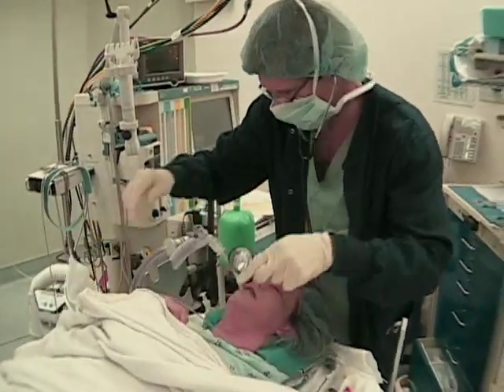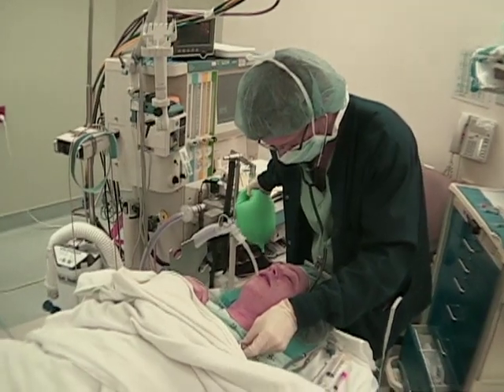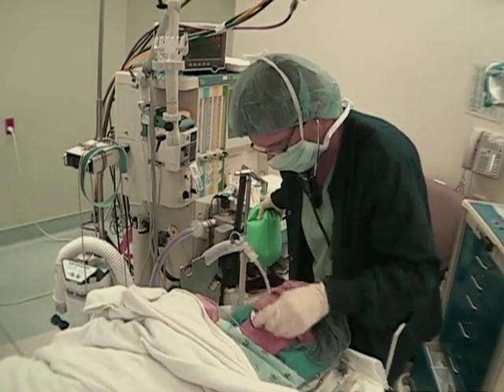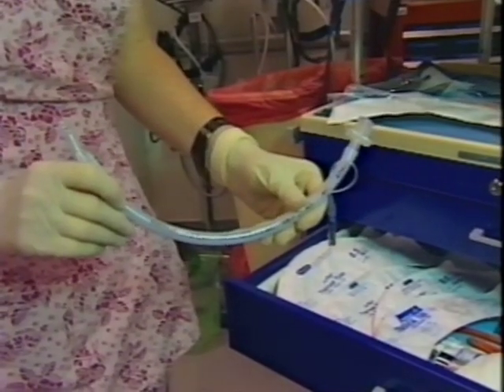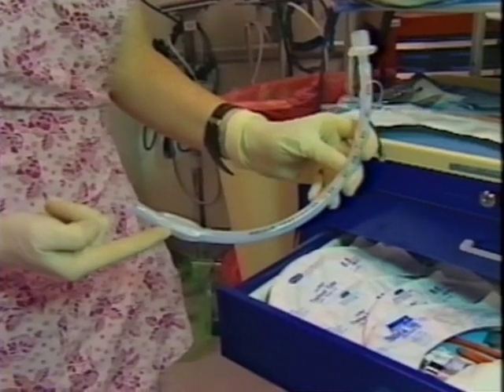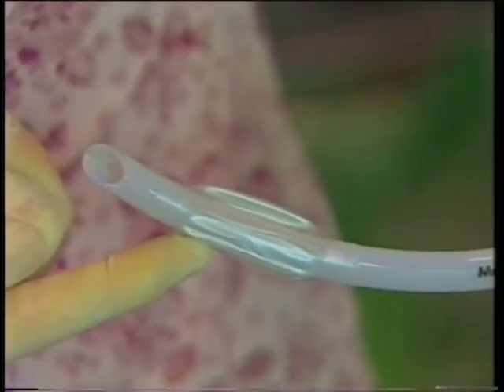Positive pressure ventilation depends on providing enough pressure to inflate the lungs. If there is a break in the pressure seal, such as through a leak around the endotracheal tube, then ventilation may be inadequate and the patient can potentially aspirate around the tube. We use cuffed endotracheal tubes to provide this seal in adults, but not usually in infants and small children because their larynxes are anatomically different.